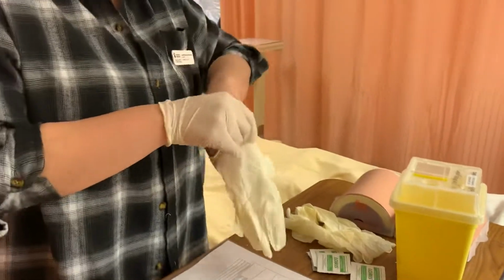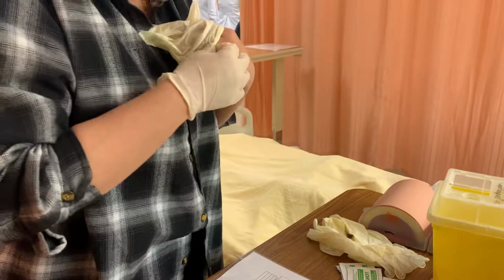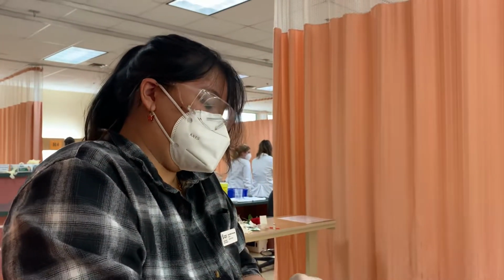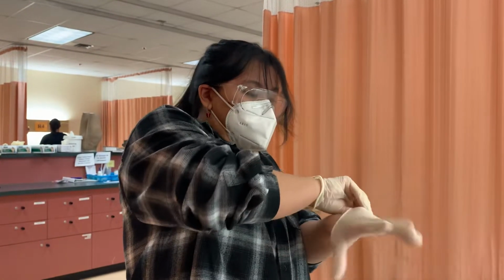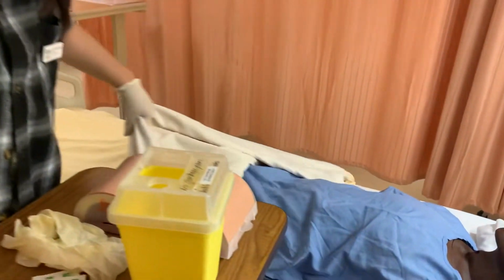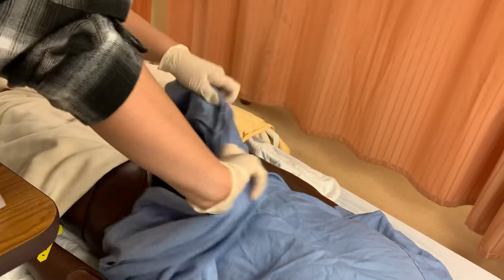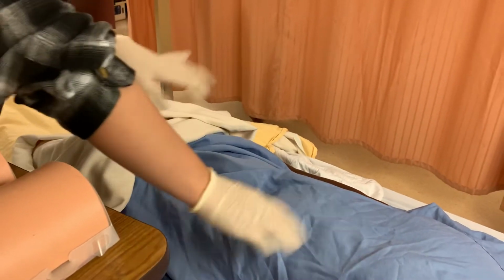So this injection is a subcutaneous injection, so it'll be in your abdomen. So it's basically going to be injected into your fatty layers. So I'll be injecting it in your abdomen. If you have a preferred side, you just notify and tell me. So I'm just gonna put this over here. So I'm just gonna lift this up and I'm going to just check where you would like it. Oh, they don't have an abdomen. Okay, I'll just pretend.